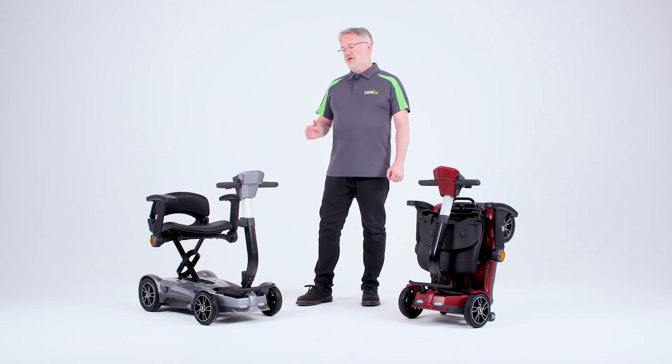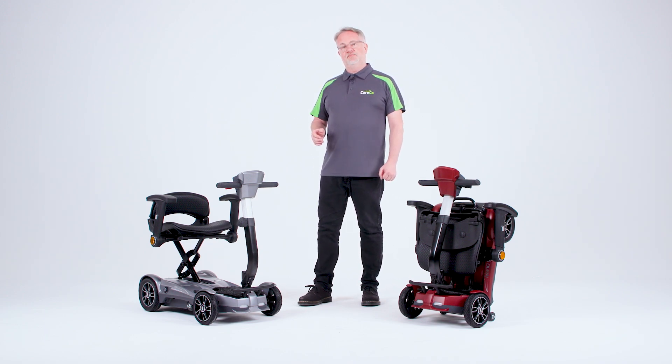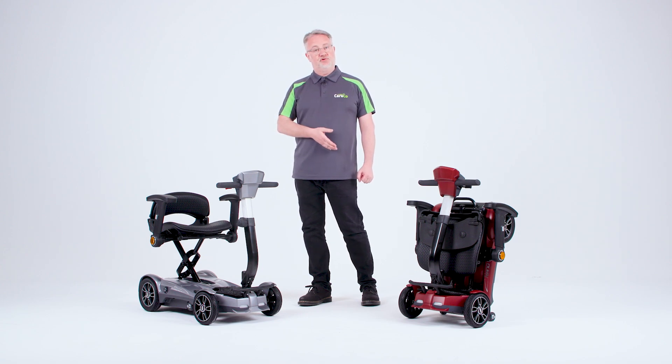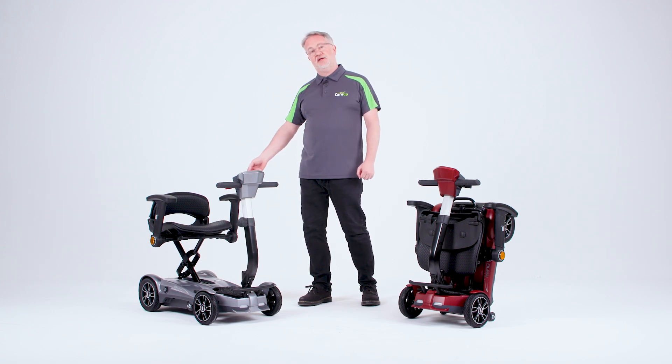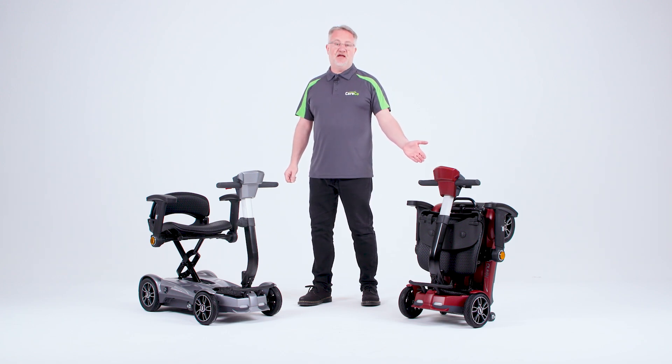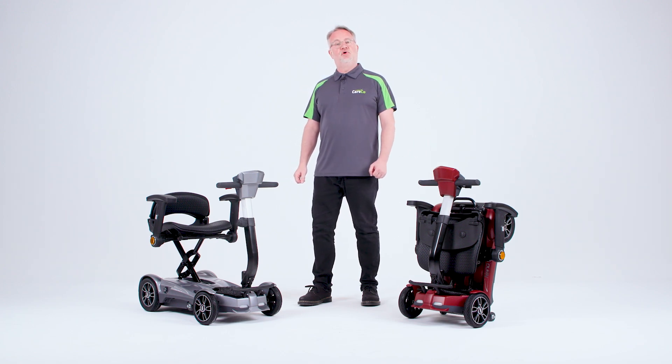As mentioned to begin with, this is an electric folding scooter and its party piece is by pressing a simple button on the remote control or on a button on the back, the mobility scooter will fold up into the position that you can see here on the left. Let's see how that works now.